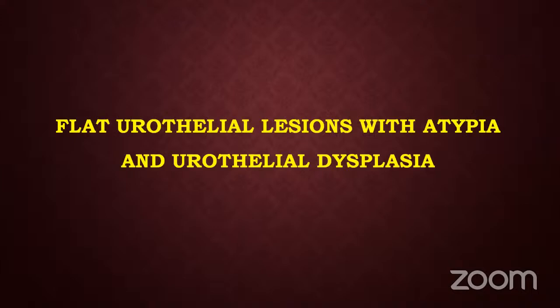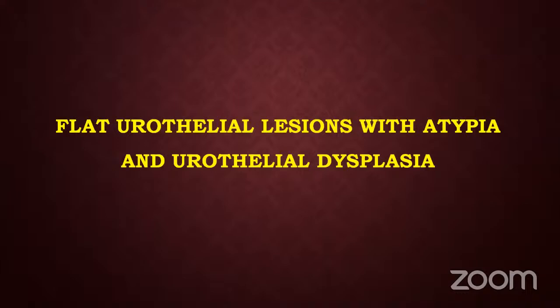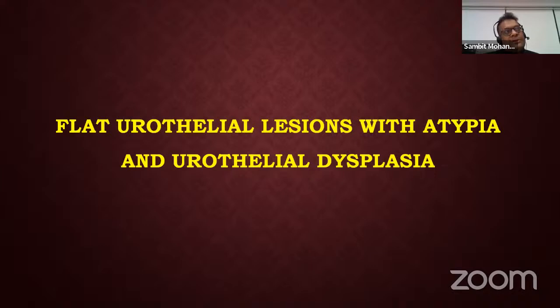If the atypia is significant, you see mitosis, and it is true atypia. Every single cell will look different from each other, and you see a lot of karyorrhectic debris. Once you see moderate to severe atypia with mitosis, even if the layering is 2-layer, you're still going to call it a cancer. Yes, because we had similar cases where the layering was less, but there was significant atypia, mitosis, and a lot of branching.